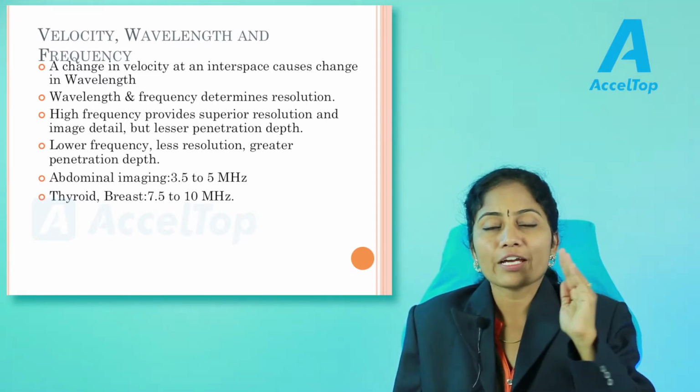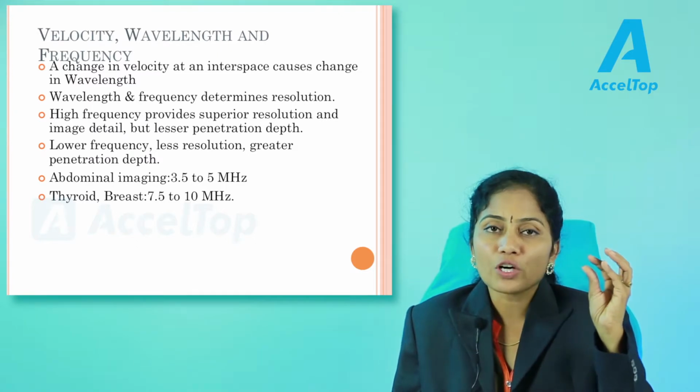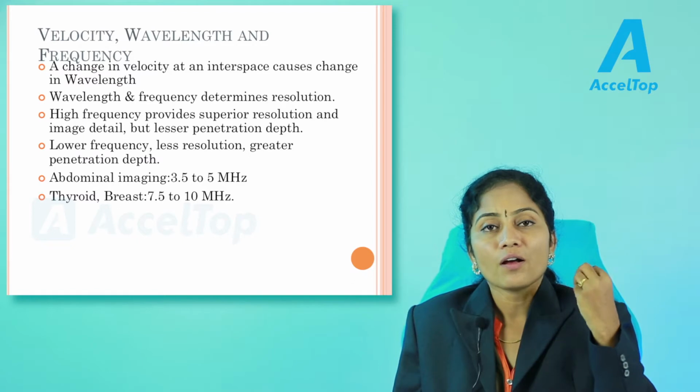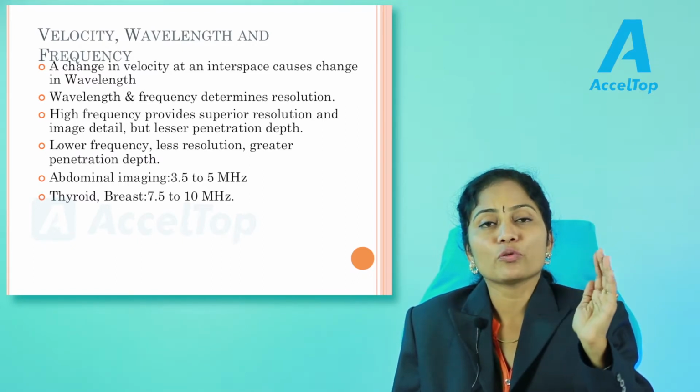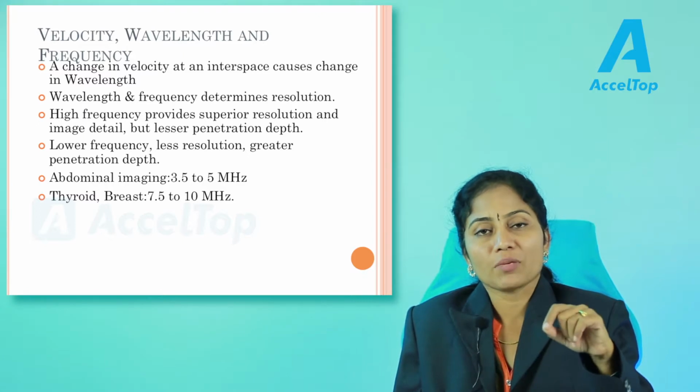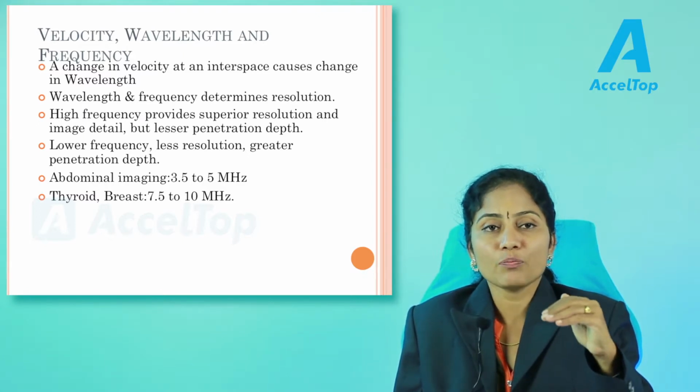Higher frequency probes have a shorter wavelength, whereas lower frequency probes have a longer wavelength, and those are used for deeper structures. In the abdomen and for obstetric images we use lower frequency probes.